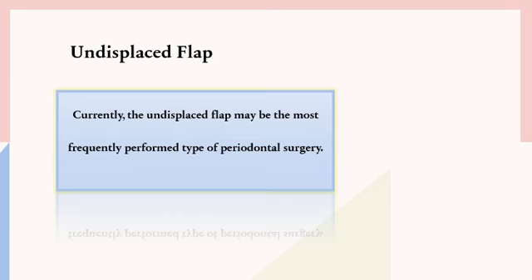The other flap that I want to discuss is the undisplaced flap. Currently, the undisplaced flap technique may be the most frequently performed type of periodontal surgery. So the most common type of flap used is usually the undisplaced flap, unless we have limited keratinized tissue.